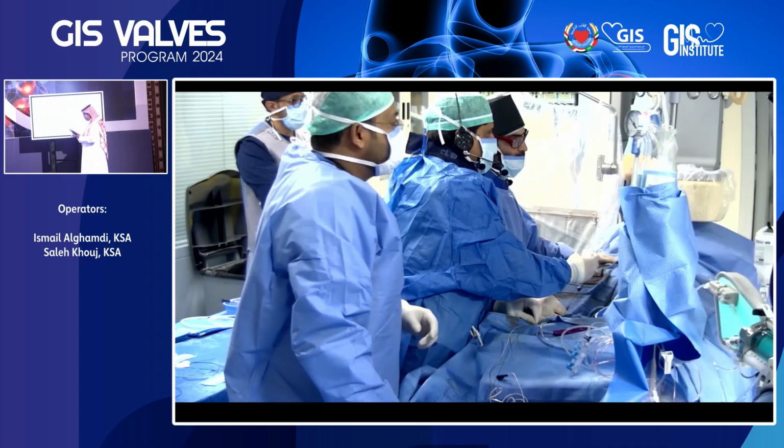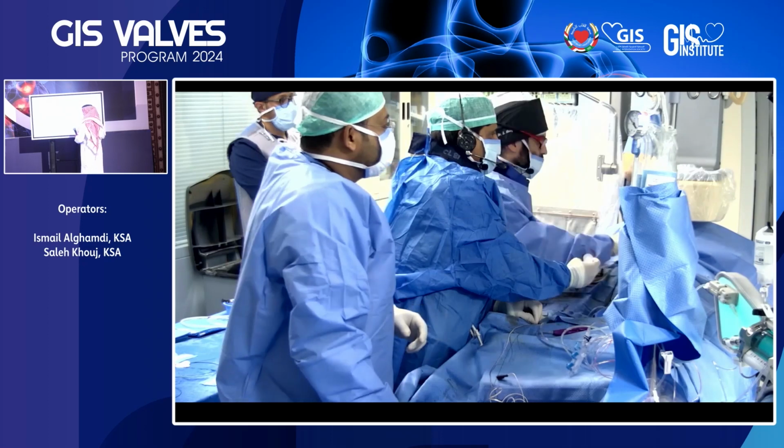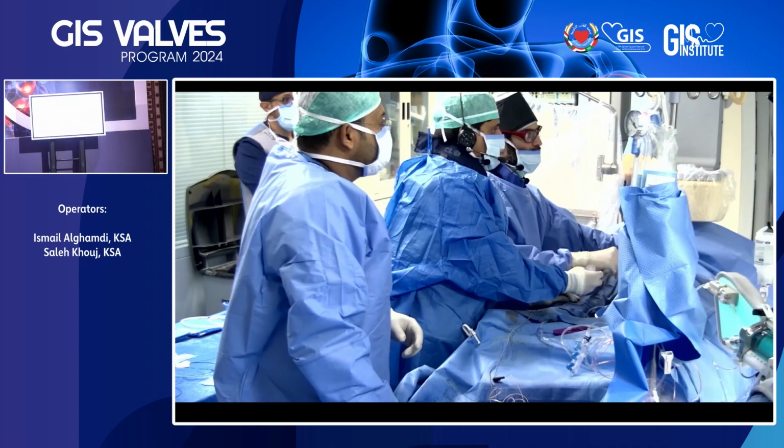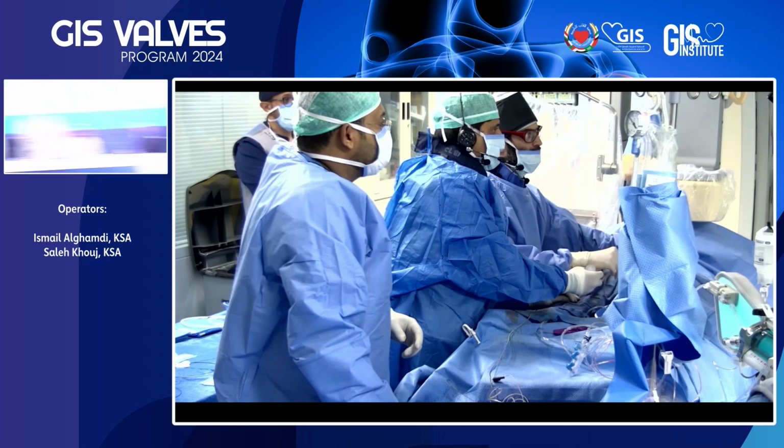Okay, so Dr. Saleh, we went over the measurement quickly. We're going to poll the panel to see, first of all, Abdurrahman, predilate or no predilatation, what size valve? I think the measurements are good to match it, because this is a bicuspid valve. It's not tricuspid, where you can take the measurement as it is.